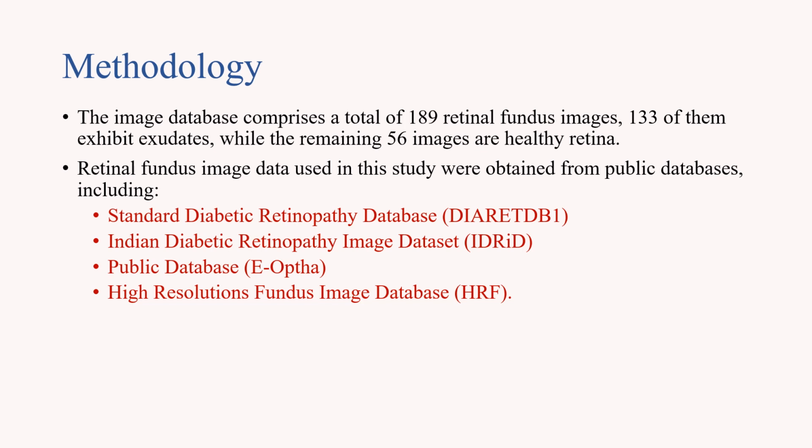We use a total of 189 retinal fundus images, 133 of which exhibit the exudates, while the remaining 56 images are healthy retina. Retinal fundus image data used in this study were obtained from public databases, including the Standard Diabetic Retinopathy Database, Indian Diabetic Retinopathy Image Dataset, Public Database, and High Resolution Fundus Image Database.